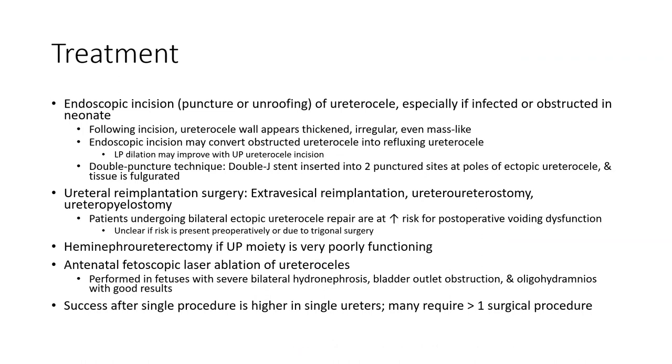Treatment: endoscopic incision of the ureterocele, especially if infected or obstructed in a neonate. Following incision, the ureterocele wall appears thicker, irregular, even mass-like. Endoscopic incision may convert an obstructed ureterocele into a refluxing ureterocele. Lower pole dilatation may improve with upper pole ureterocele incision.